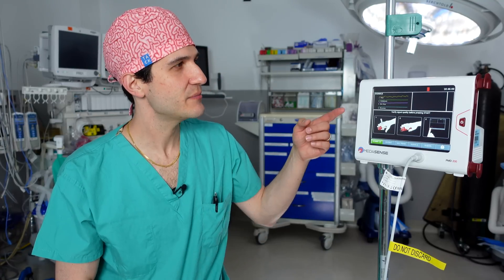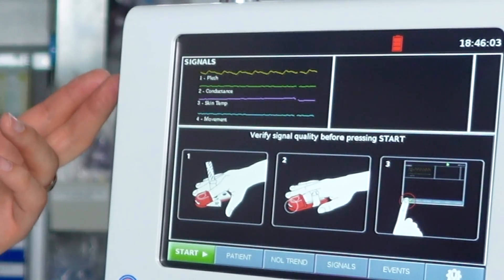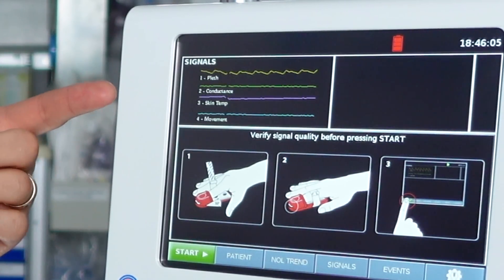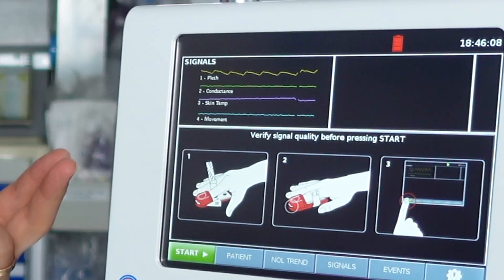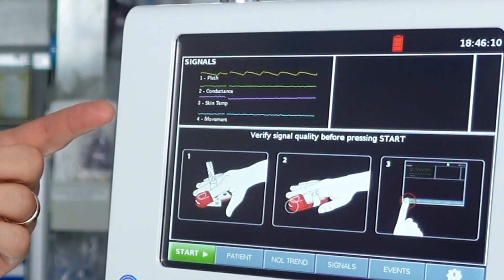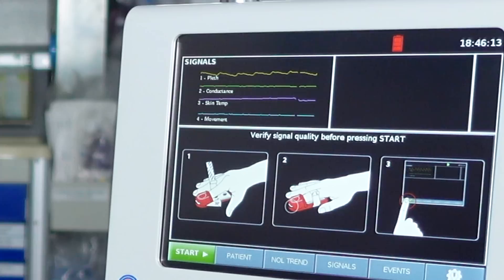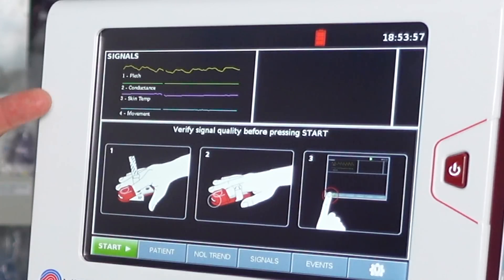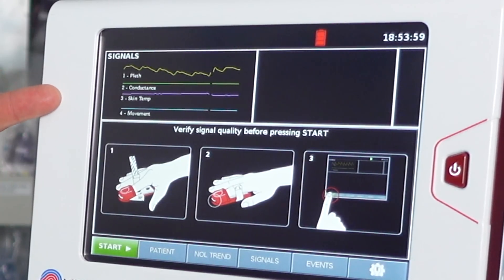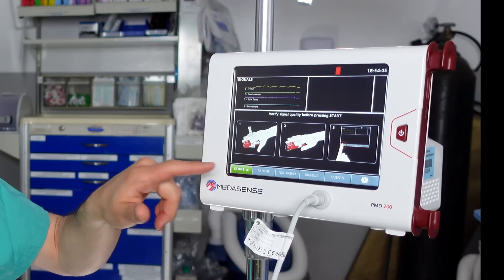Now with the device powered on you can actually see the signals that it measures. That includes plethysmography, which is changes in circulation; conductance, which is the amount of electrical conduction of a patient's skin; skin temperature; and a line for movement. We'll follow the simple instructions on the screen to verify signal quality before pressing start. All of these signals look fine — I've got the device on my finger and I'll press start. The device is now calibrating and coming up with a number.